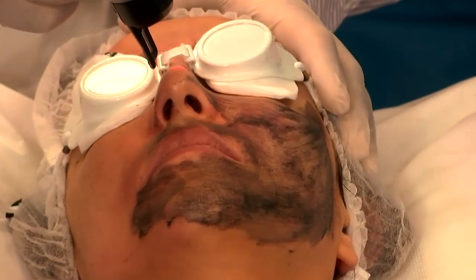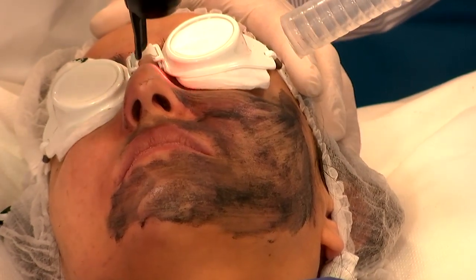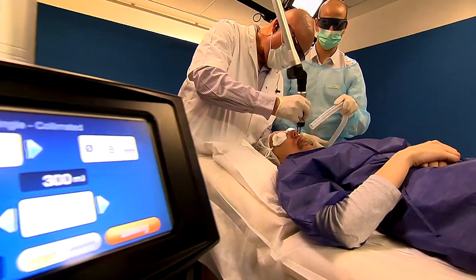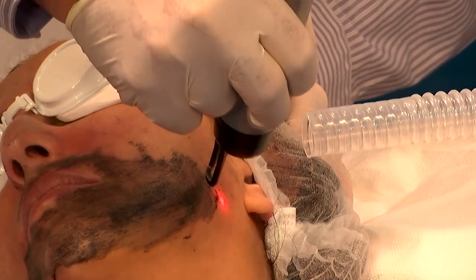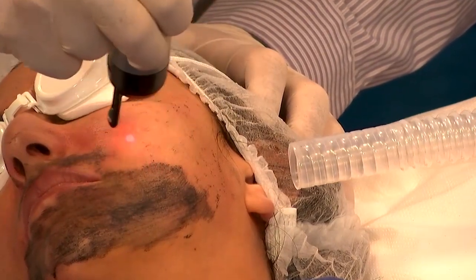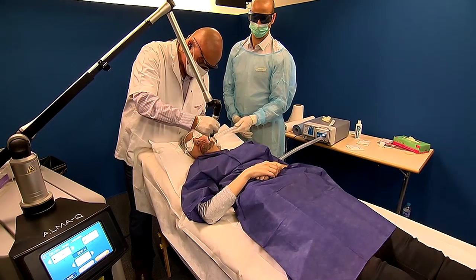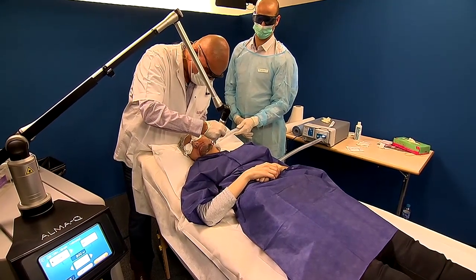Here, on the nose, you have to do it a little faster because it might be a little itchy and uncomfortable, but we have a very easy patient here. The patients are very happy to come back and do this again and again because, as I said, it's painless, it's a short procedure, no downtime, and no complication.